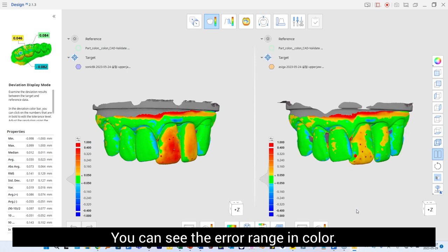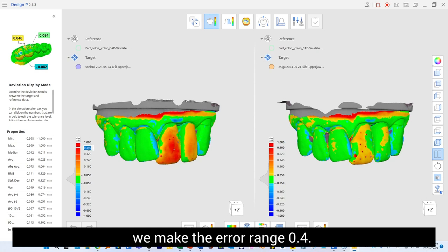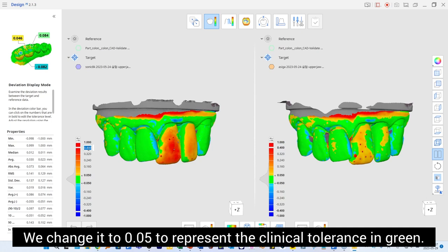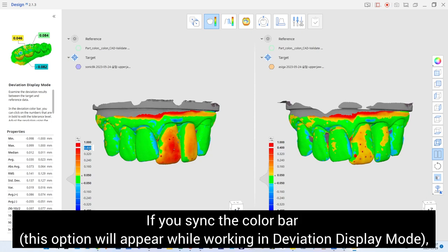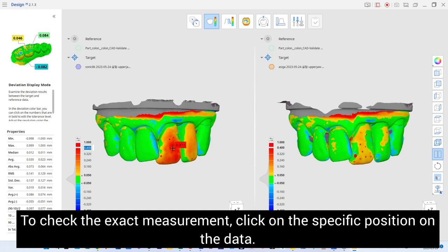You can see the error range in color. Since the maximum error is between 0.3 to 0.4 millimeter, we make the error range 0.4. We change it to 0.05 to represent clinical tolerance in green. If you pinch the color bar, each value will change on both sides if you change it for one of the data sets. To check an exact measurement, click on the specific position on the data.